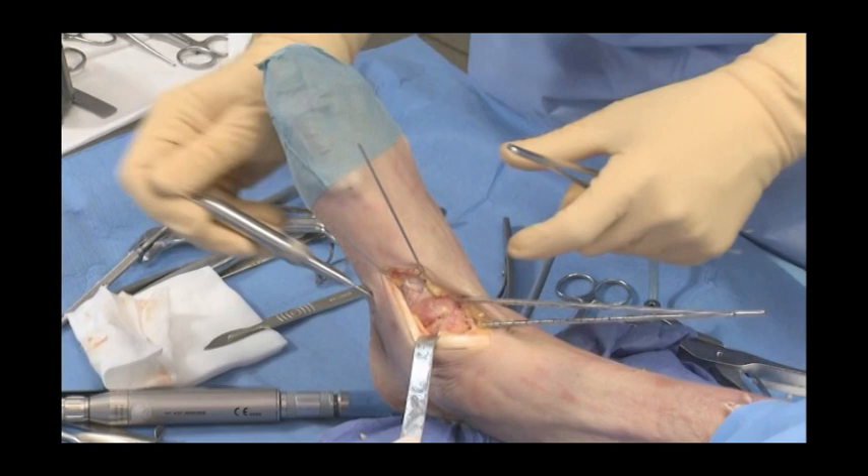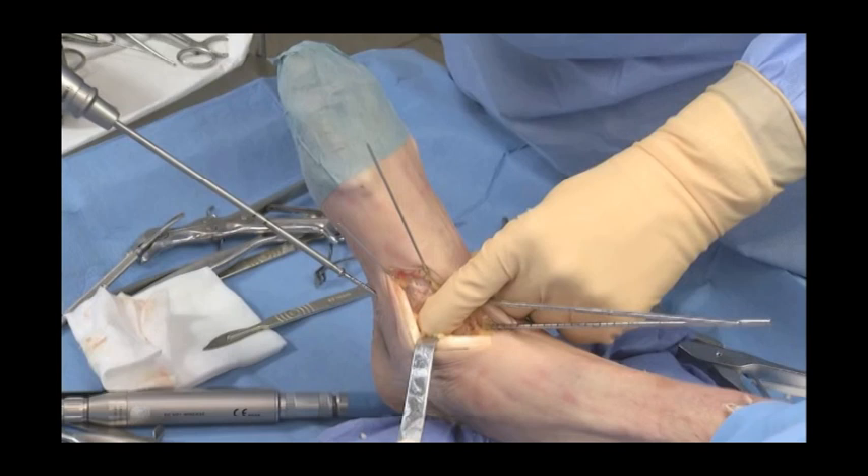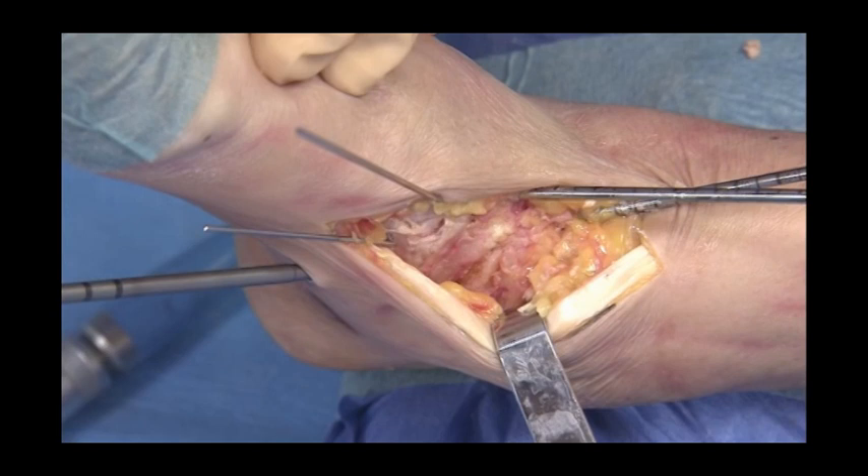A 3.5mm lag screw is placed percutaneously on the distracted side depending on the pre-op deformity. Here the foot was flat, so it is placed on the medial side.